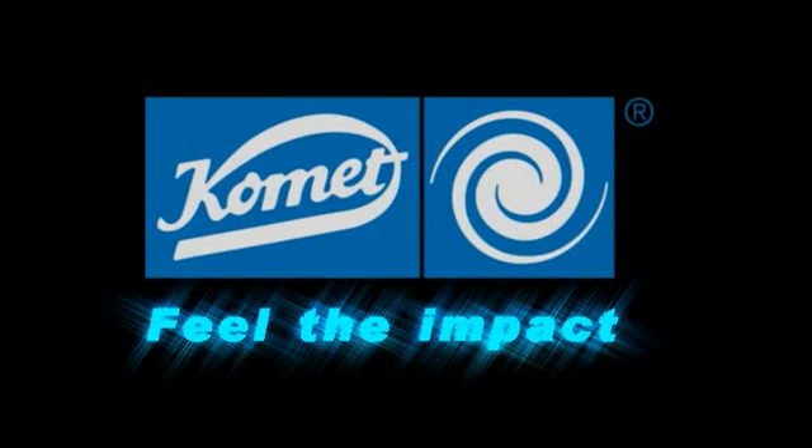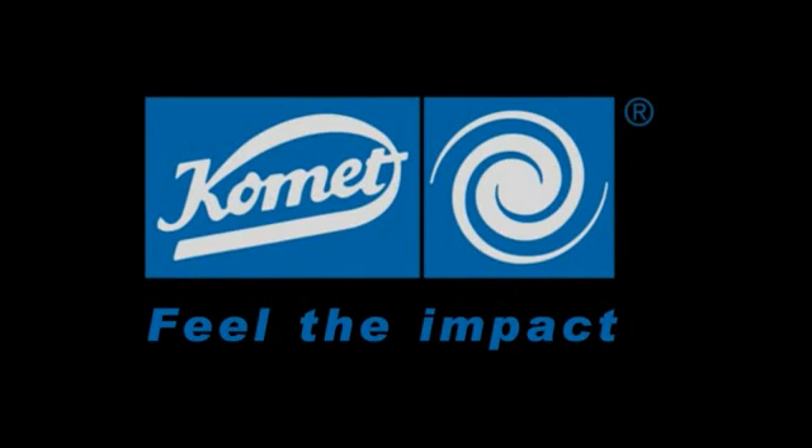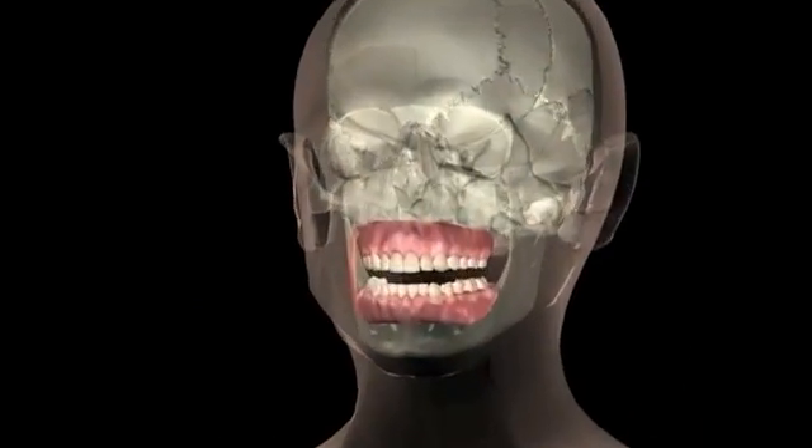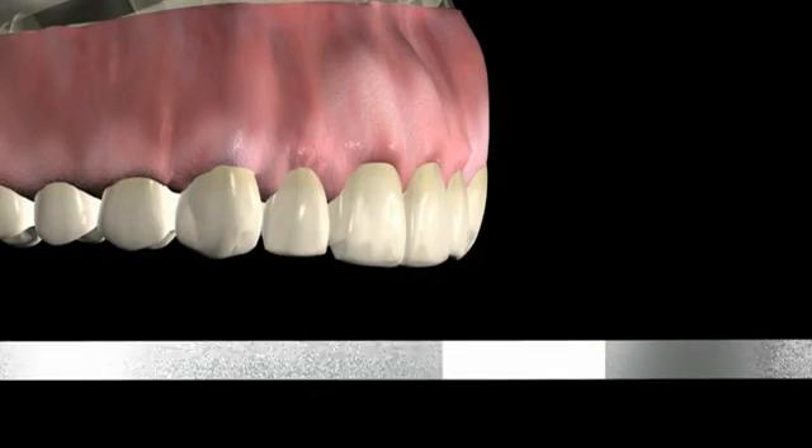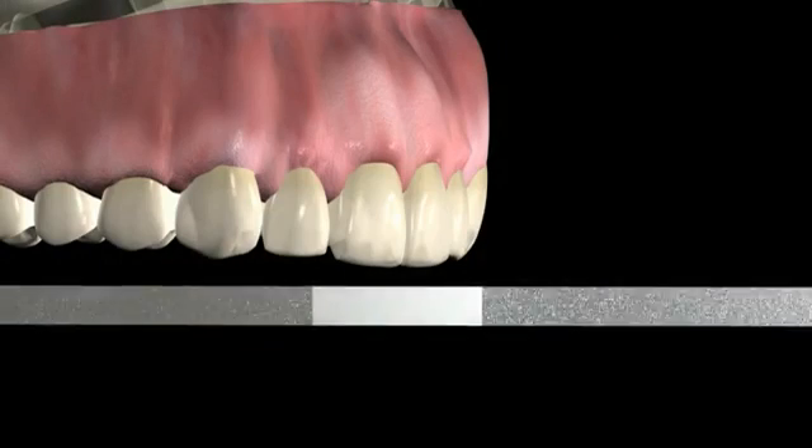Feel the impact. Comet USA introduces the innovative OS system, which was designed for safe interproximal enamel reduction and doesn't require the use of a disc guard.